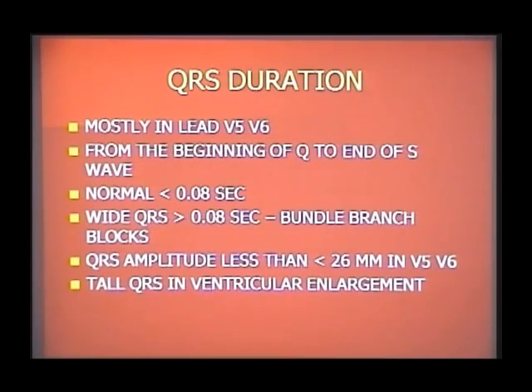So whenever my QRS duration is wide, say 0.16 seconds, what does it mean? My QRS is wide, big. That means my entire heart is not depolarized by the specialized conduction system, isn't it? That means one portion of my heart muscle is getting a slow conduction.